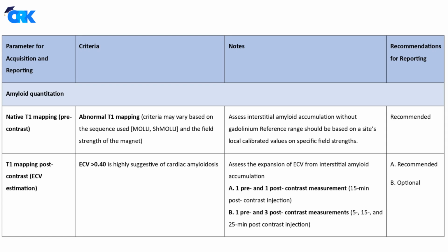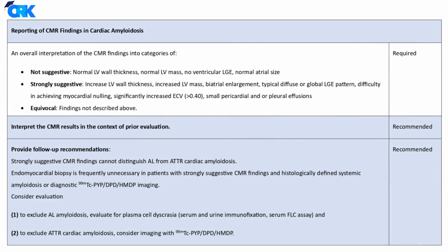These tools are especially valuable when integrated with LGE findings, wall thickness, and functional markers, giving a complete tissue characterization profile of cardiac amyloidosis. With quantitation, you're no longer just describing morphology, you're measuring pathology. And in diseases like amyloidosis, where early diagnosis can change the clinical trajectory, these values are more than numbers, they're indicators of treatment potential.